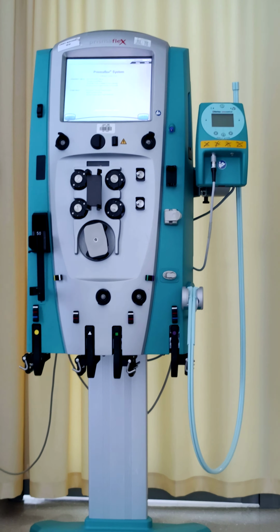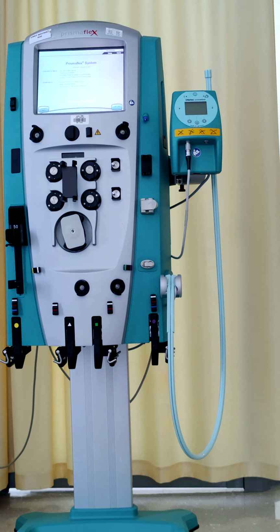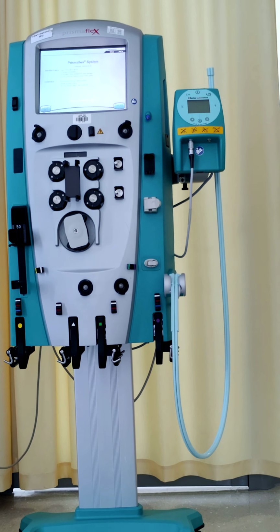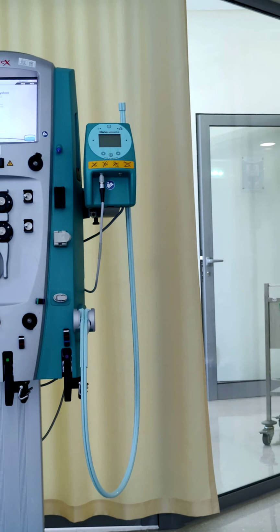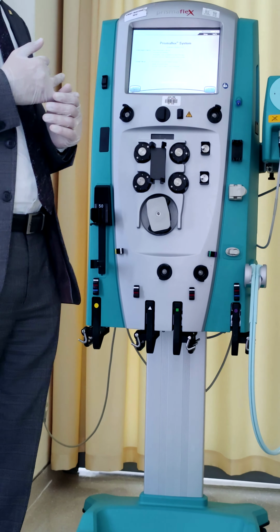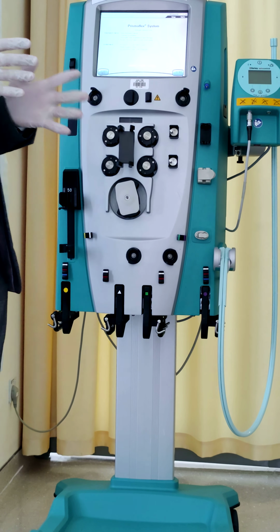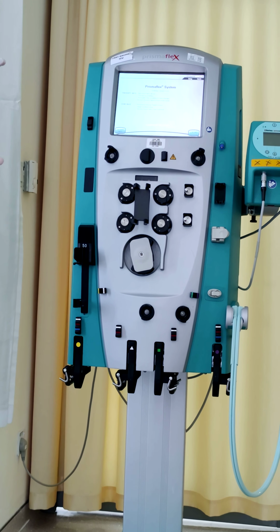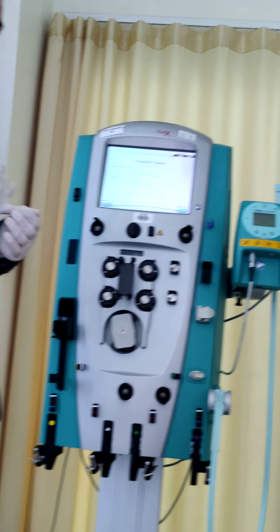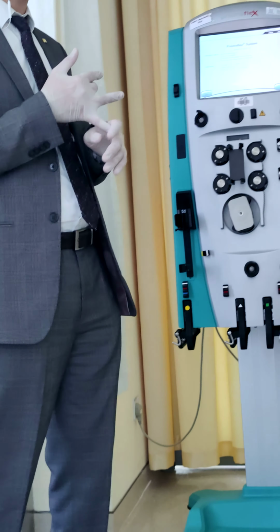Regarding settings, what do I have to set, as a doctor? What is my role? What do I have to set in the machine? The prescription. You will mention the blood flow, usually the same as CRRT, 200 or more. Usually we are not increasing it too much, between 150 to 200 in this range. This is for adults, sure. But first thing in the prescription, the blood flow.